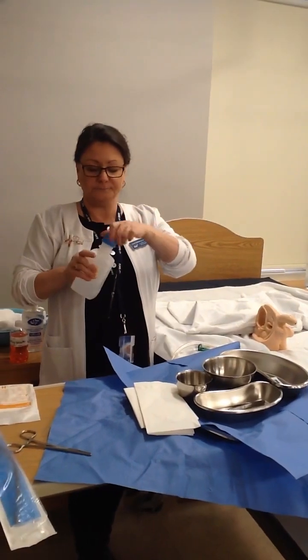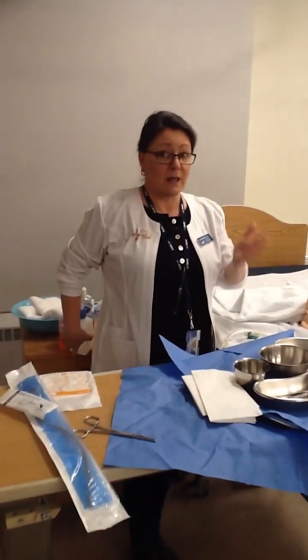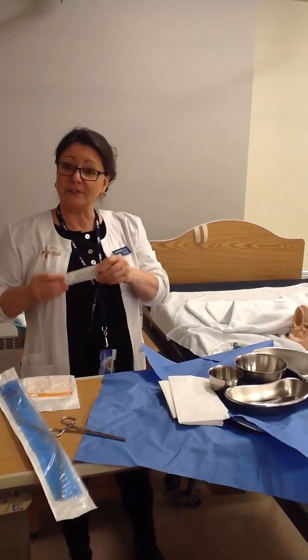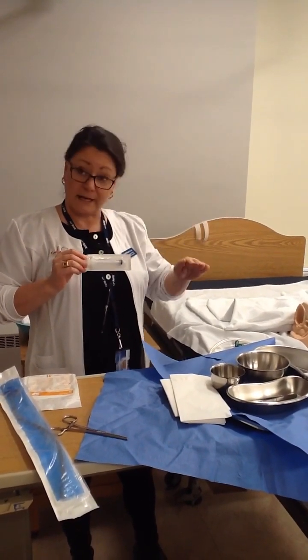Put the cover on, and reach behind me without turning my back. Okay. Next, I'm going to add my 10 mil syringe that I need to fill and connect to my catheter.